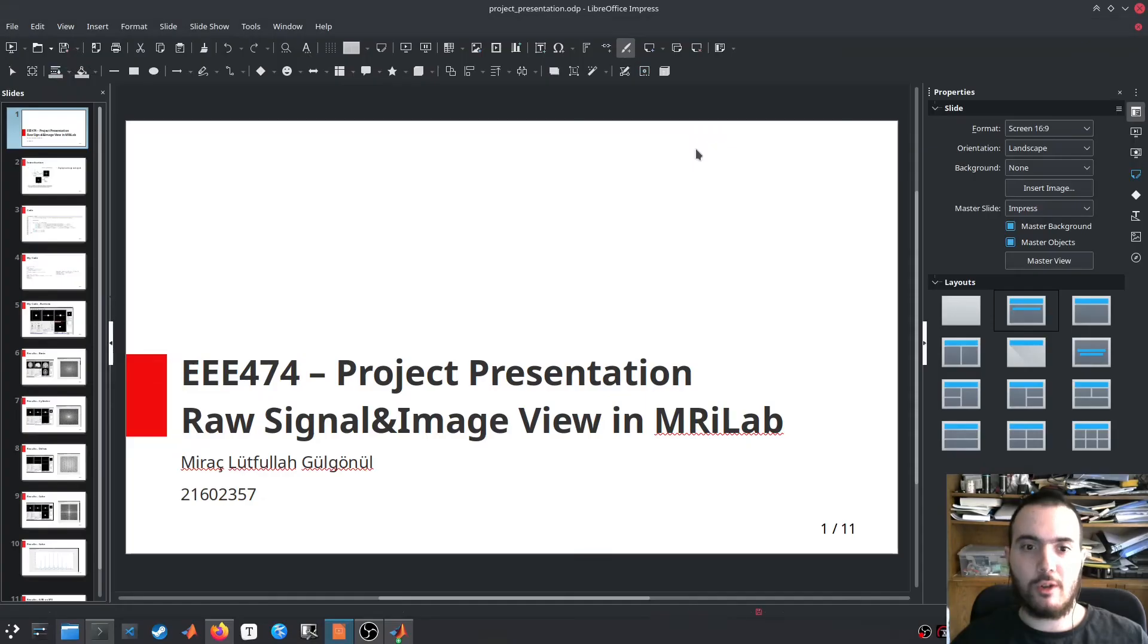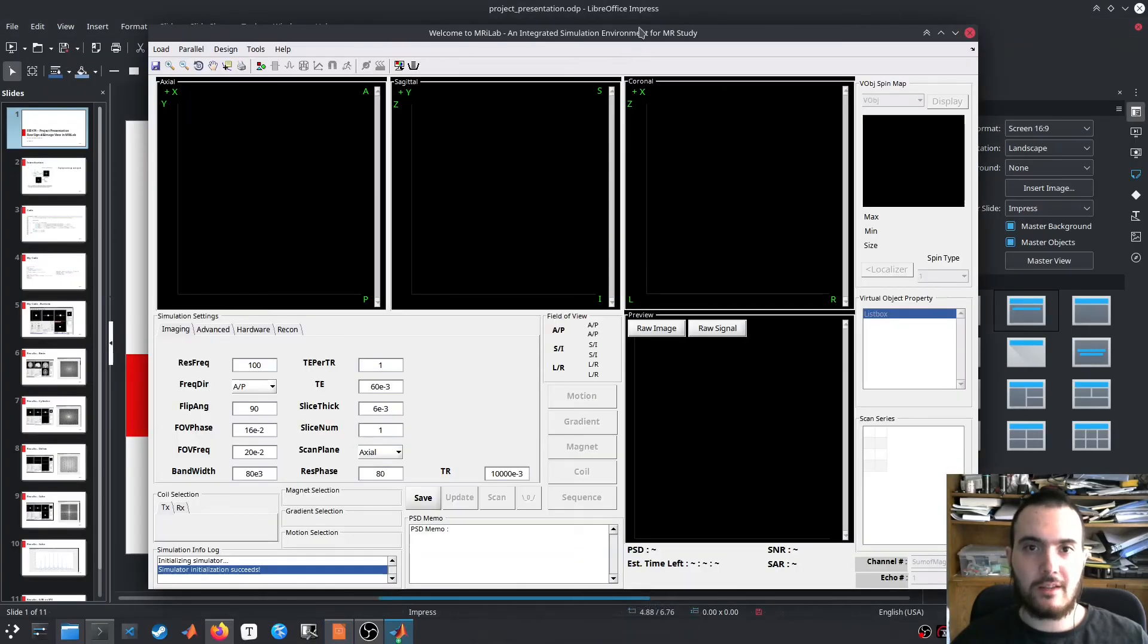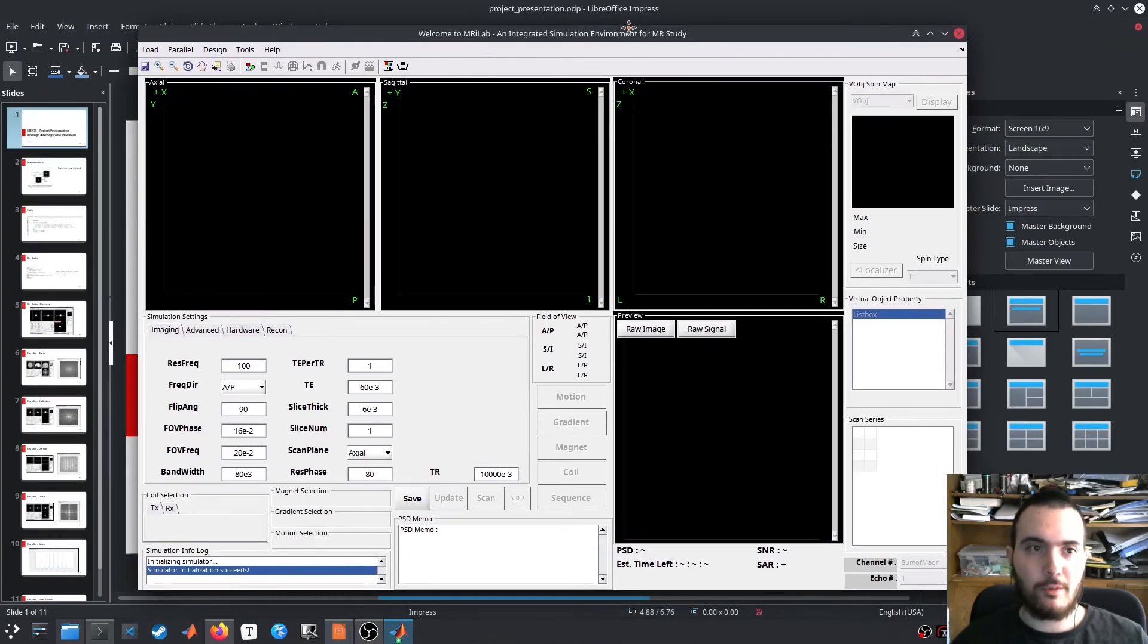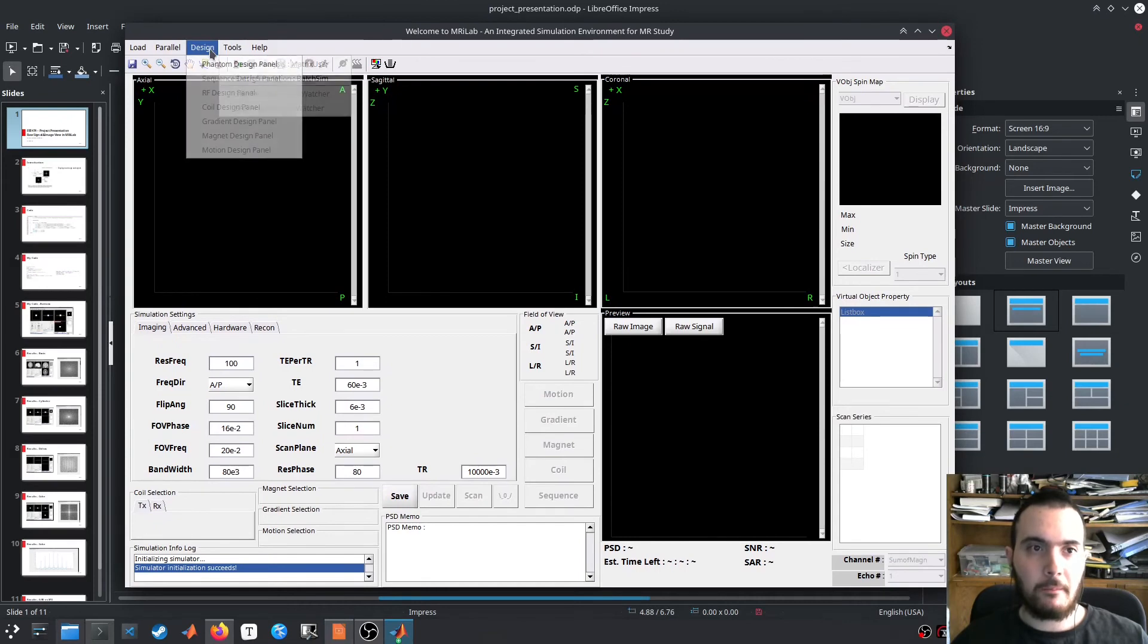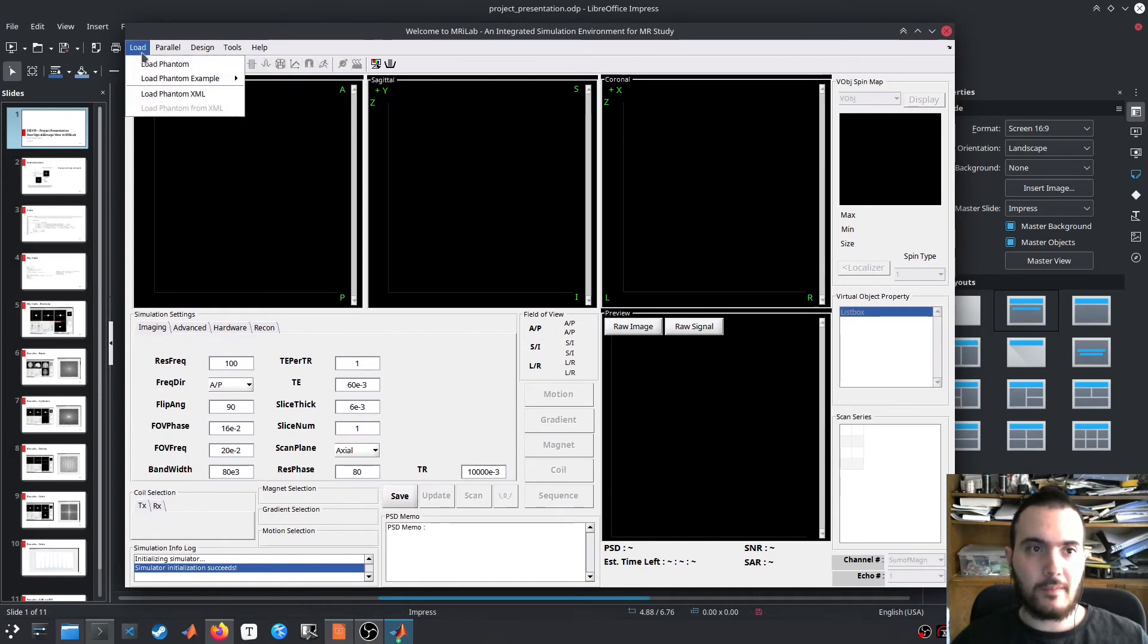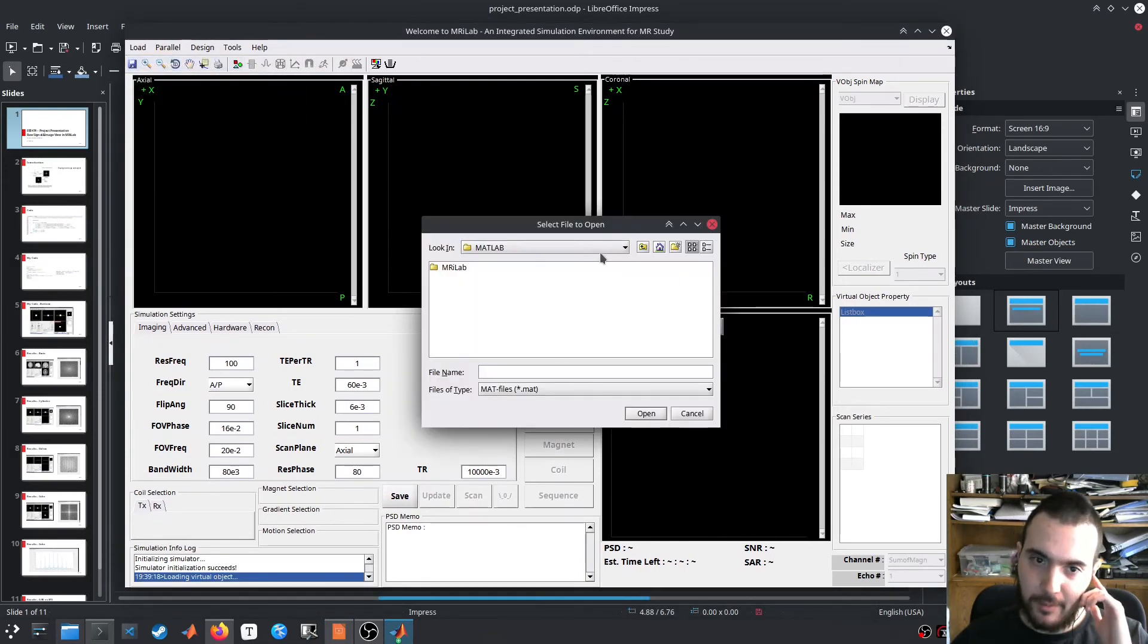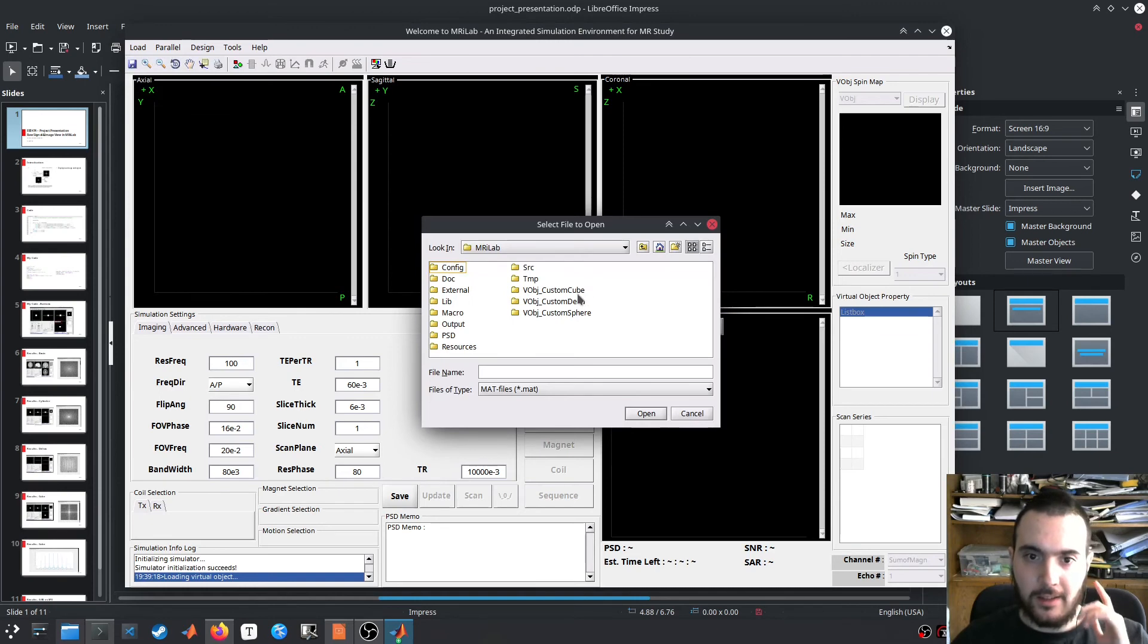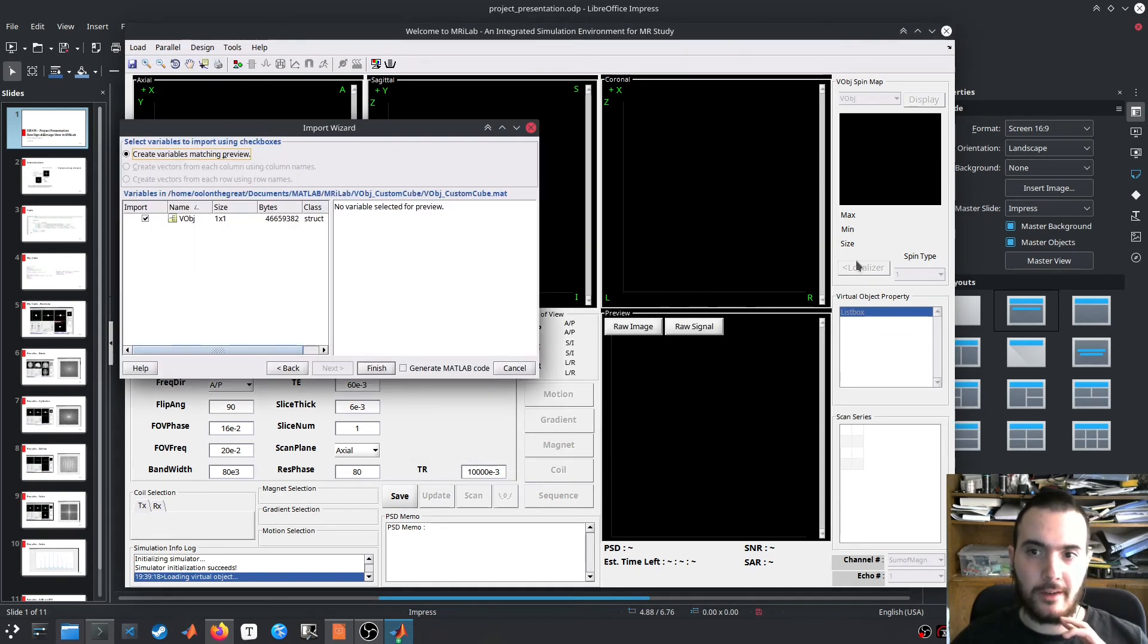We will also do a live demo here. This is the MR lab software in MATLAB. First you load a phantom image. Let's load the custom cube object that I made here.